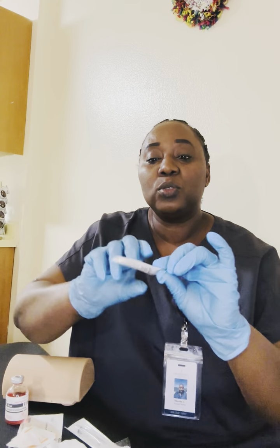It is still valid. I have a 3 ml syringe, and my needle is 22G by 1 inch. I'm going to set that one up. Take the vial, use the alcohol swab to clean the top of the vial.